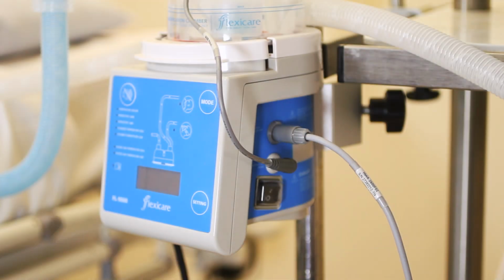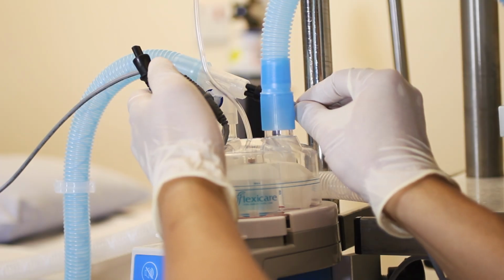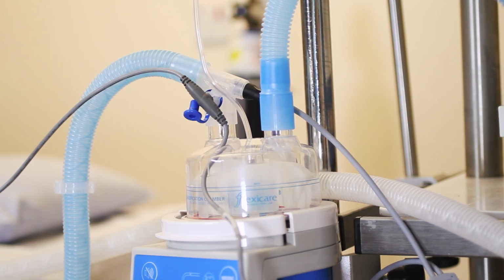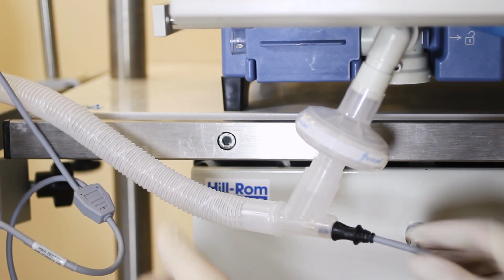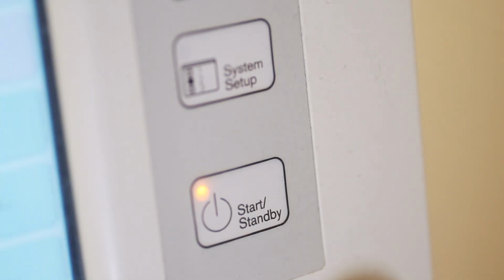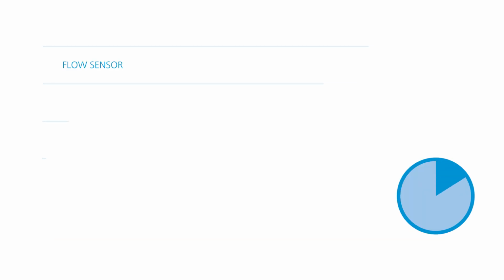Connect the heated wire lead to the DIN socket on the side of the FL9000 respiratory humidifier heater. If using a dual heated wire adapter lead for a dual heated wire system, as in this case, the shorter of the two leads is inserted into the cloverleaf connection on the elbow of the inspiratory limb. The longer lead of the dual heated wire adapter is attached to the elbow of the expiratory limb. Connect the ventilator to the gas supply and carry out the functional tests following the ventilator manufacturer's instructions for use.